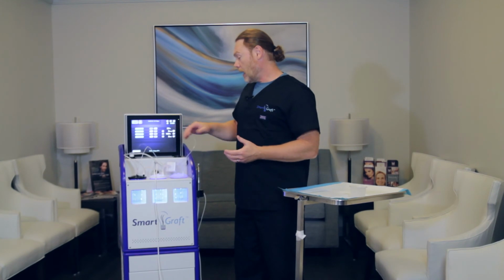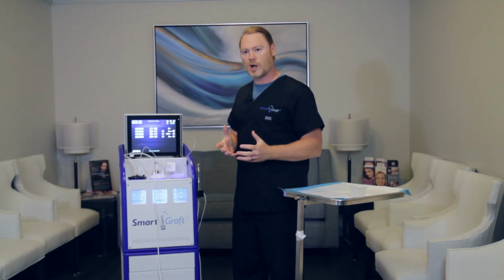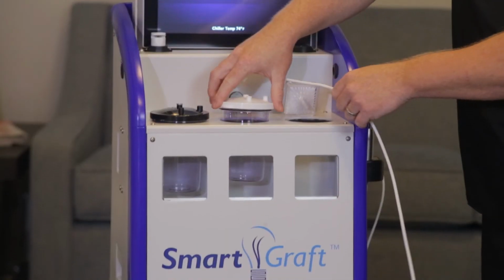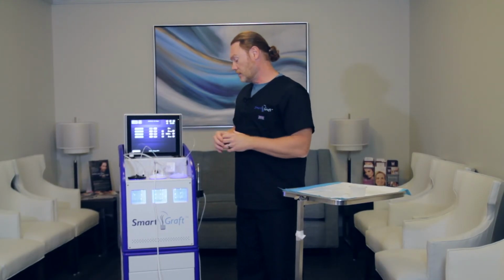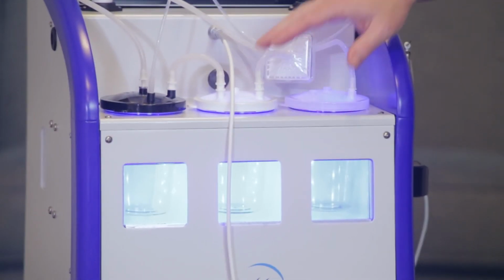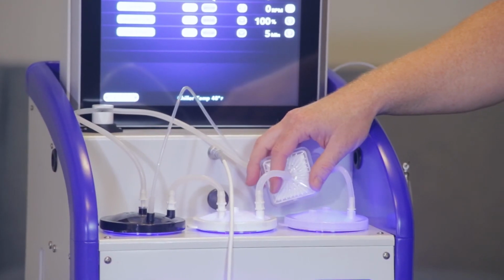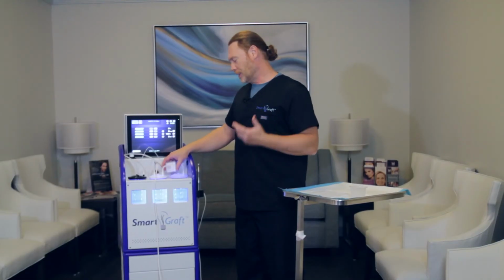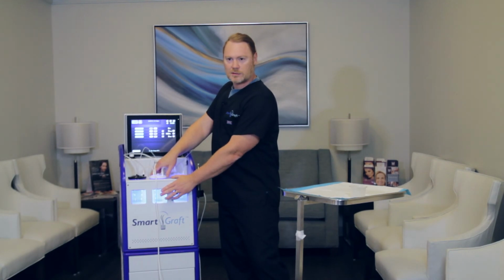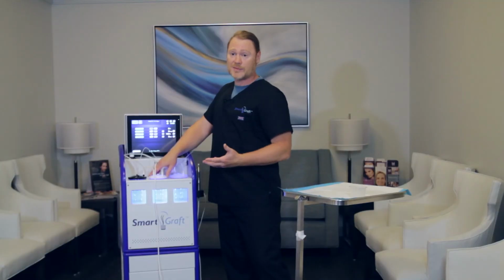So after turning that off, there is one other troubleshooting issue that I like to say is that one thing you need to make sure of, absolutely without a doubt, is that you do keep an eye on the saline level here. You will need to stop the device if this water level gets too high and empty the canister. The reason for that is you do not want water to get into the system. Now, this filter is a very good high quality filter. It does stop water very well, but I don't think you really need to test that. So just keep in mind, that's why these glass window panes are here, that you can actually see the saline rise up and empty it accordingly.